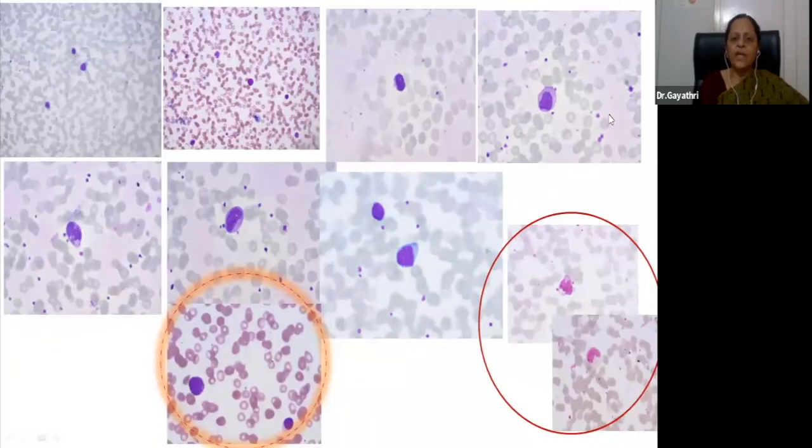A normal lymphocyte shows a pyknotic nucleus and very, very scant cytoplasm. One should look at this cell very carefully and try to get familiar with it and its size. For ease of understanding, you can compare it to the normocytic RBCs in the background. It will be slightly larger than the normocytic red cell in the given field. That's how you can familiarize your eyes with what is normal, and all the other cells here are variations.